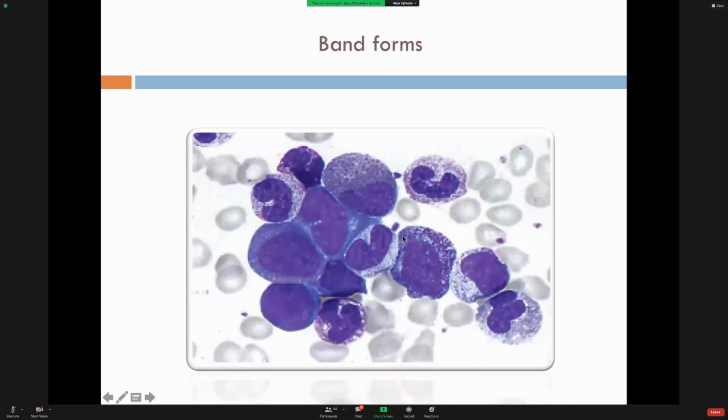This is another picture. You can see it bands. Usually abnormal cells, the nucleus, the maturation for white blood cells, with time the nucleus will shrink and get smaller. You can see this is a large nucleus. The N/C ratio is very high here. The N/C أقصد بها اللي هو النيوكليوس للسيتوبلازم. تكون nucleus usually should be smaller than cytoplasm. The N/C ratio هنا it's more. Usually premature cells تكون more dark blue, purple colors.